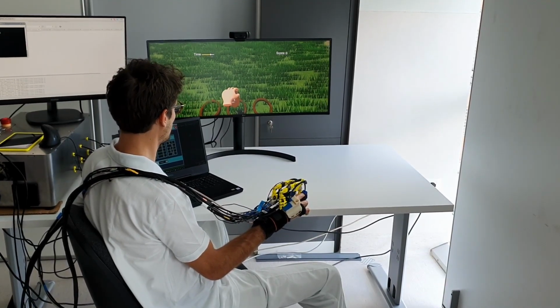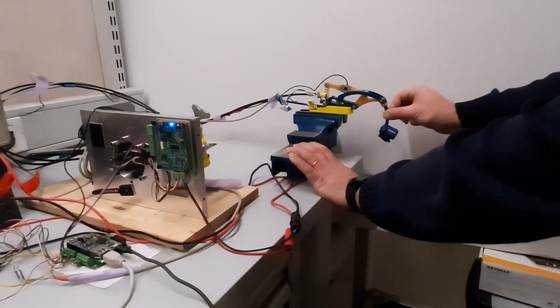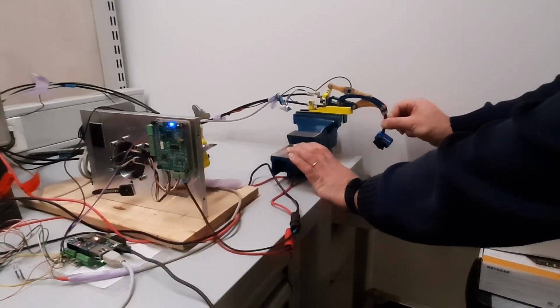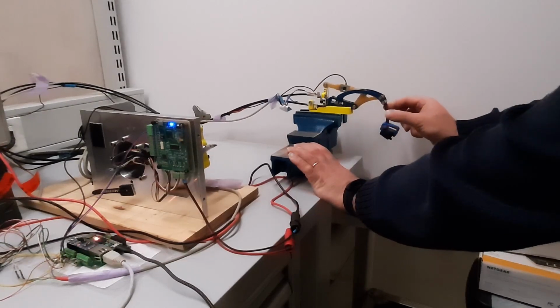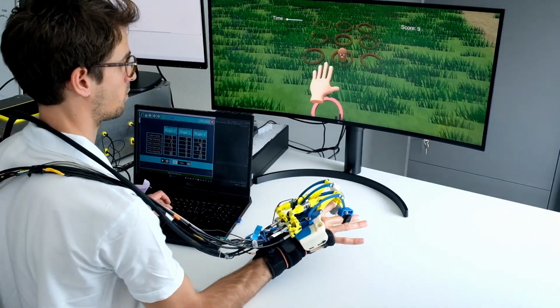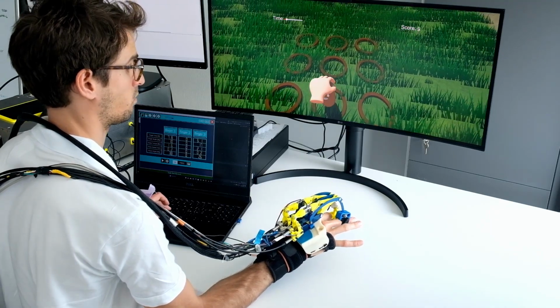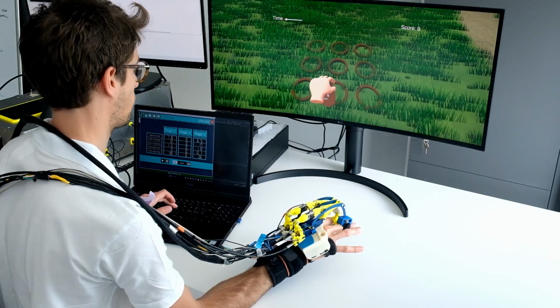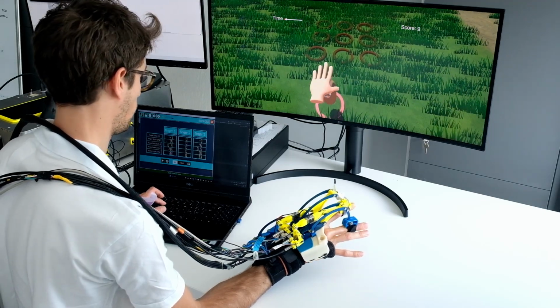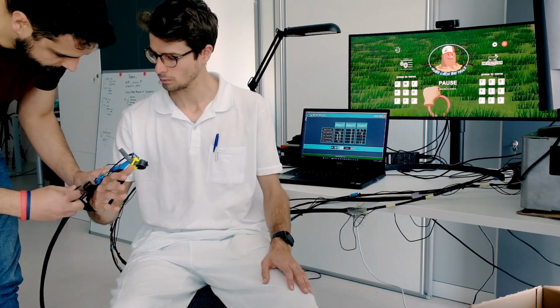During the project, we developed a new powerful exoskeleton for hand rehabilitation. The utilization of the assist-as-needed paradigm is a significant step forward in hand rehabilitation. By replicating proprioceptive stimuli through interaction with a virtual reality environment and serious games, the exoskeleton can provide tailored assistance to patients based on their specific needs. This personalized approach can lead to more effective rehabilitation outcomes.